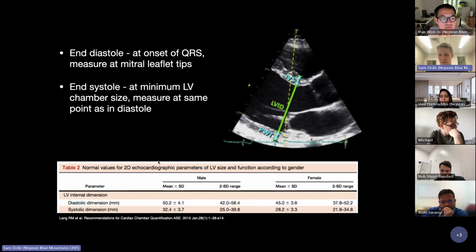I can show you some stuff that we've done on some of the volumes that I did mainly with 3D, but I think it's really hard to get volumes accurately in the critically ill. I'm just about to say with the systolic function, I think that we steal all the guidelines from the cardiology literature. I totally buy that volumes would be great for people who can get reliable ejection fractions, reliable 3D volumes in particular. They're shown to be more accurate than the 2D. I think sometimes this is not translated easily over into the critically ill. So you've got to have good imaging. I think volumes would be the way to go, but you've got to have good images.